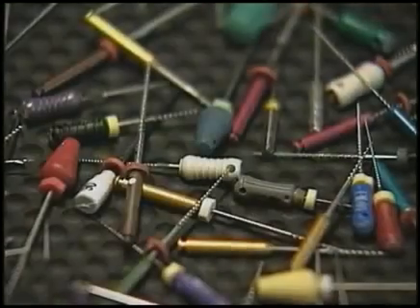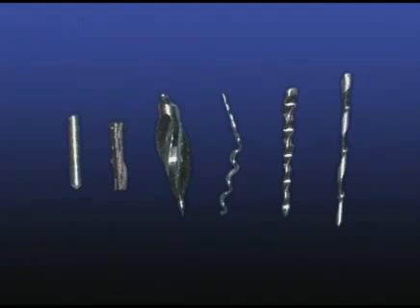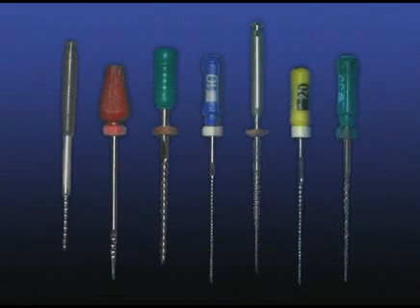With the advent of microscopes and ultrasonics, the thinking has radically changed. Today, virtually any instrument can be removed by most clinicians, even if it only partially lies in the straightaway portions of the canal. Most clinicians would think of files when we say broken instruments, but the term also applies to the tip of a silver point, the core of a thermophil carrier, a Gates-Glidden burr, a Lentulus spiral, or any man-made obstruction left behind in the canal. This tape will deal mainly with files as obstructions since they are the most common offenders.